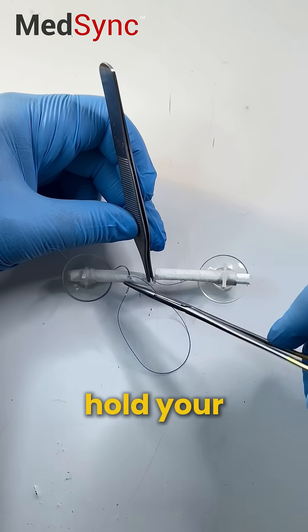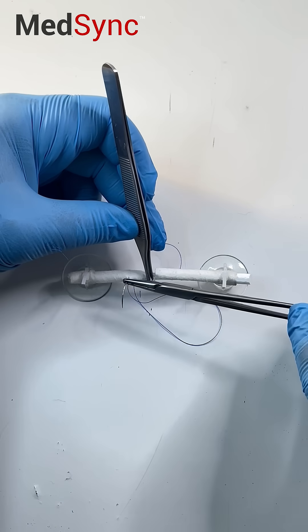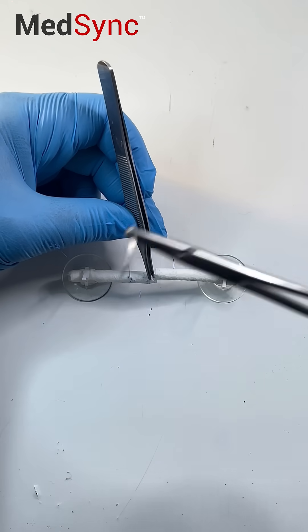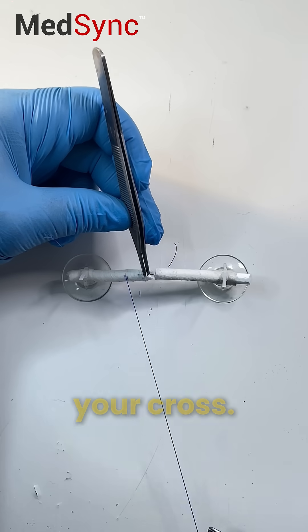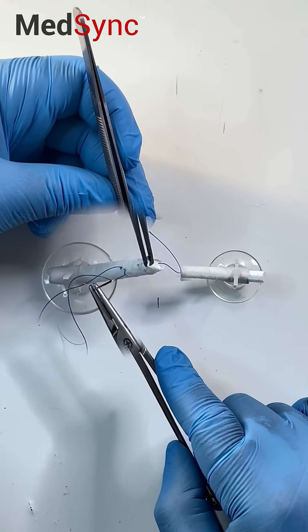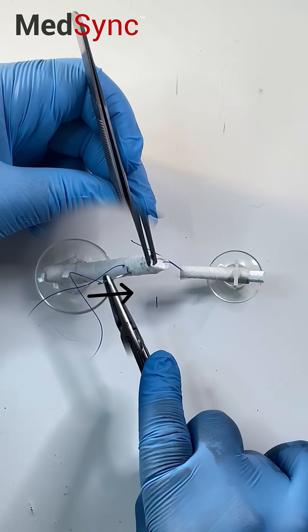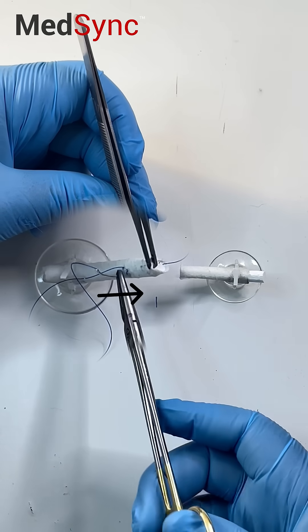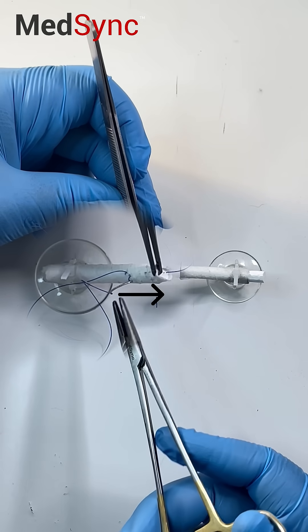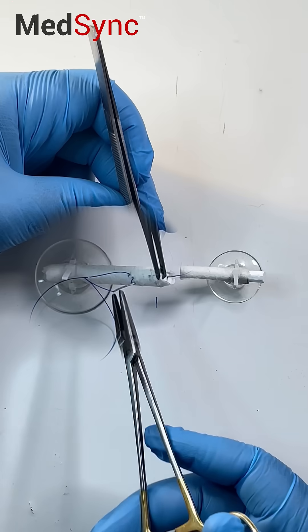Be flexible with how you hold your needle holder, mount the needle straight away and pull. You need to complete your cross, so place your suture distal to this strand right here. Take a bite exiting at the site of division and keep the counter traction on the tendon end.